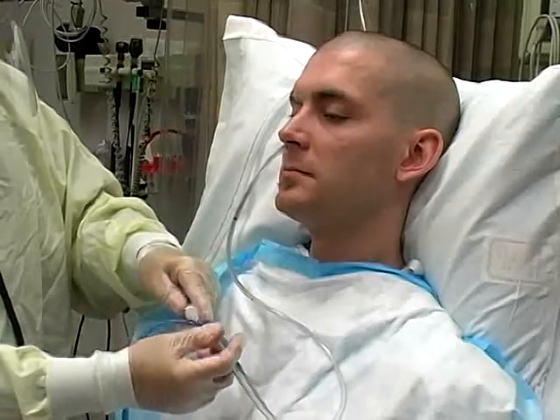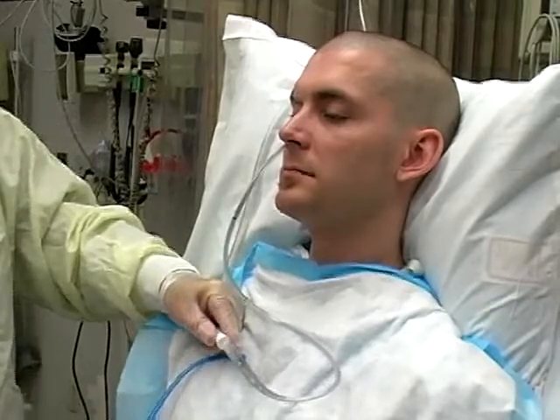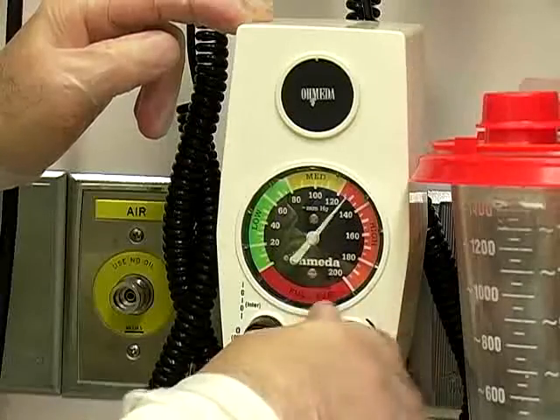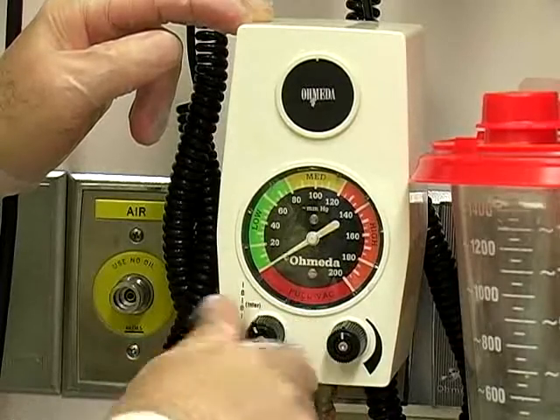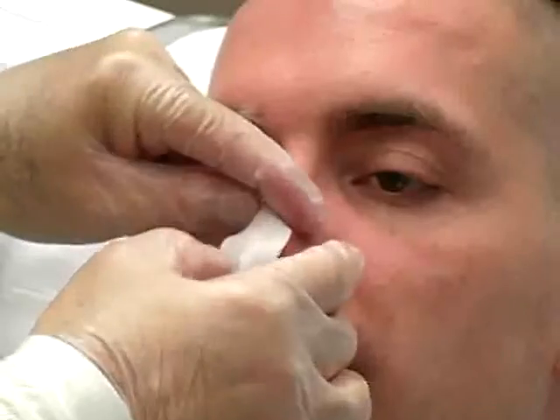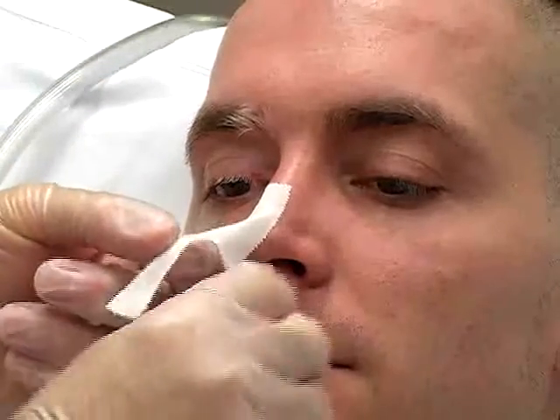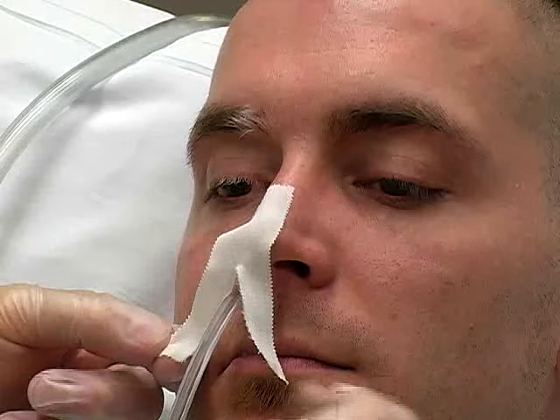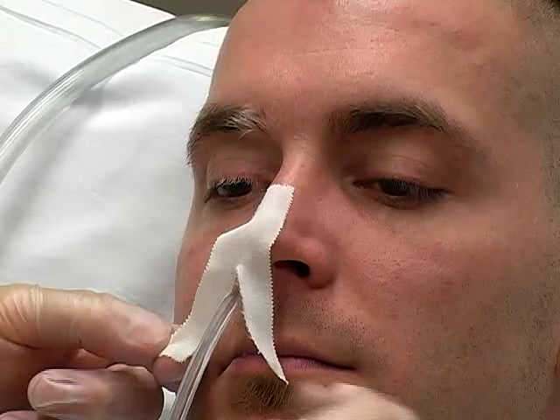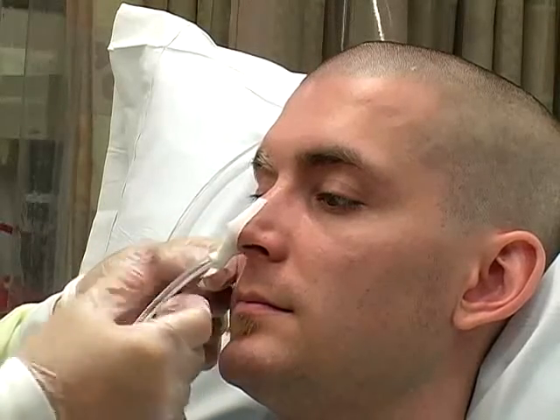After proper placement has been confirmed, attach the nasogastric tube to the suction tubing. Adjust the vacuum force to low or medium and set the control dial to the intermittent position. Finally, secure the tube to the patient's nose. First attach a piece of adhesive tape, ripped vertically 1/2 of its length, to the patient's nose. Then, wrap the tails of the tape in opposite directions around the tube.